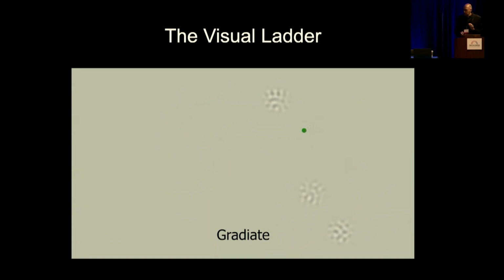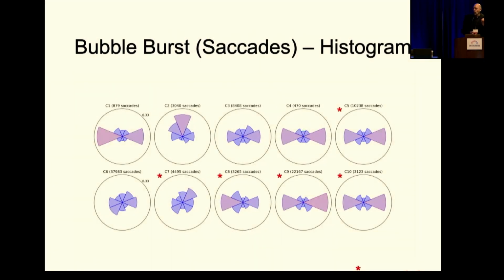And from this, we can do a number of quantitative analyses about not just where you're looking, but how you look, and how your look or gaze changes as information on the screen changes. So for example, these are saccades. These are the fastest movements our bodies can make, and we use them to move around the visual world to put our fovea in that information.